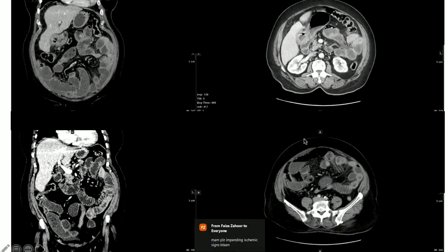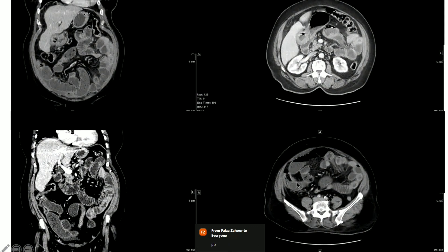This is a similar case — another patient. This is the fistula and this is the dropped stone.